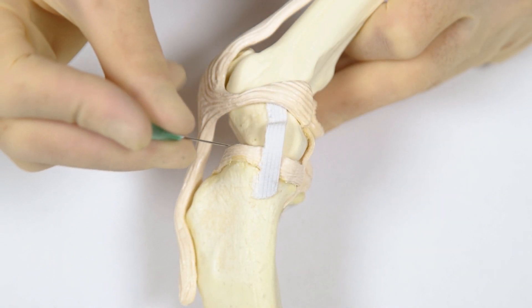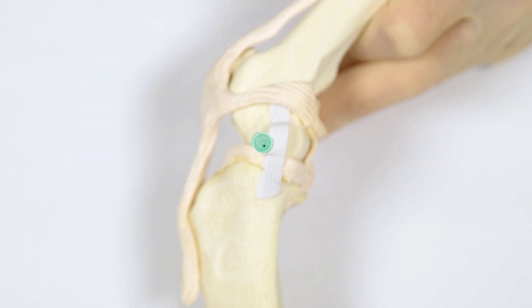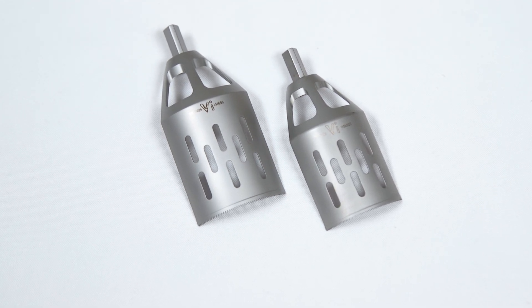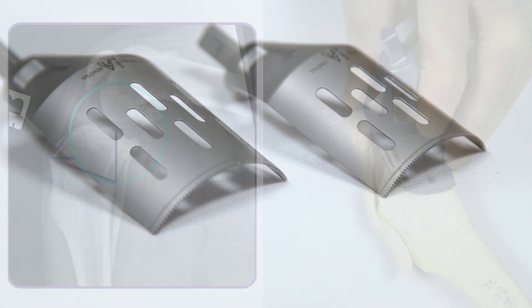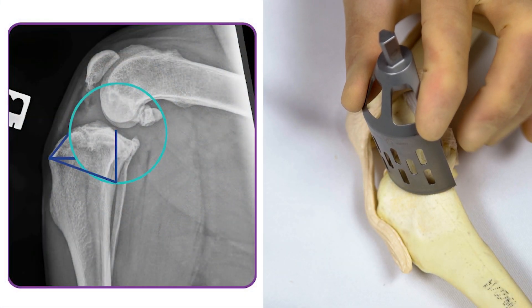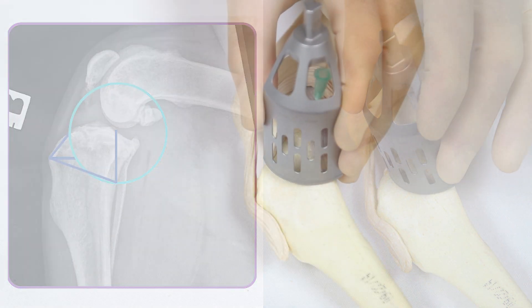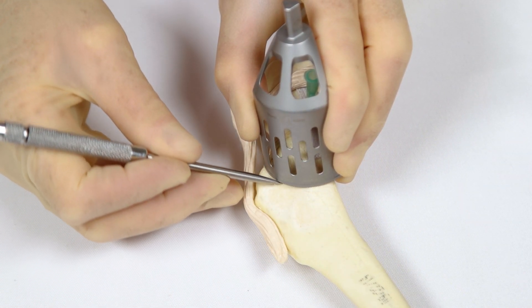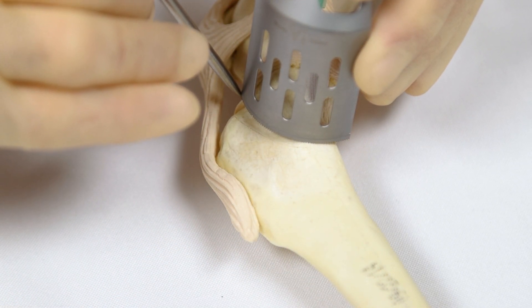A short hypodermic needle is inserted into the stifle joint, just cranial to the medial collateral ligament. This needle acts as the center of the TPLO osteotomy. A specialized curved TPLO blade is selected of the appropriate size as determined by the preoperative planning. The blade position is checked against the tibial landmark measurements as per the preoperative plan. The osteotomy position is lightly marked onto the bone using either a bone scribe or diathermy and positioning is double checked against preoperative landmark measurements.